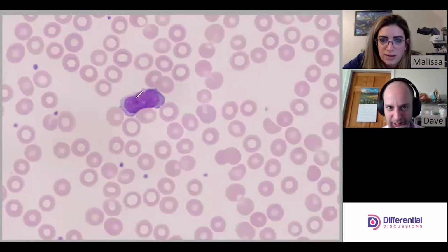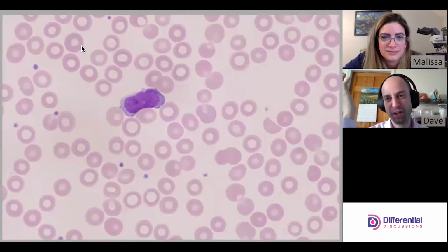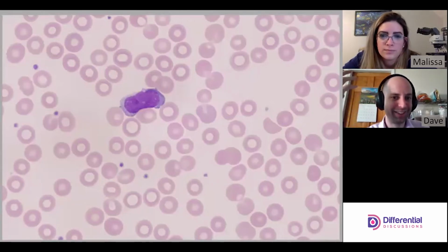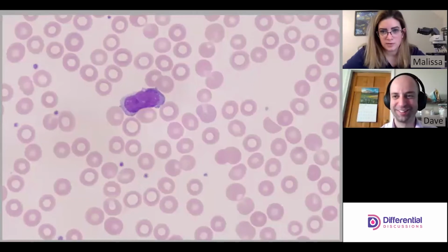Yeah, I think it's all one piece though. So this is a tricky call. I don't think there's any way to get around it. Part of me is thinking mono, but I could see someone arguing lymph as well. Yeah, this one's a challenging one.